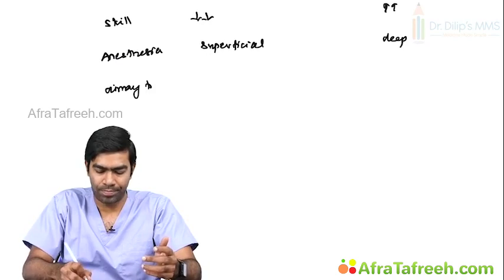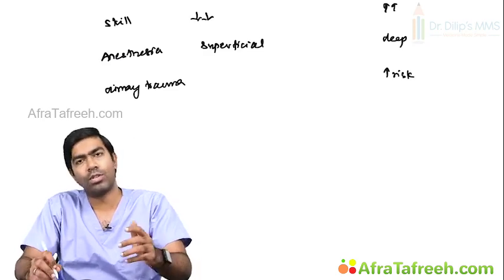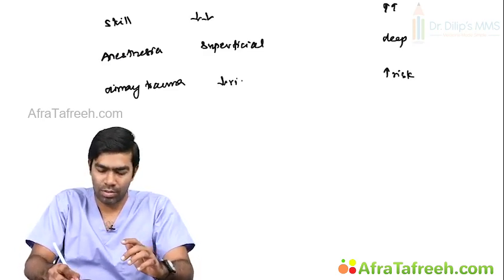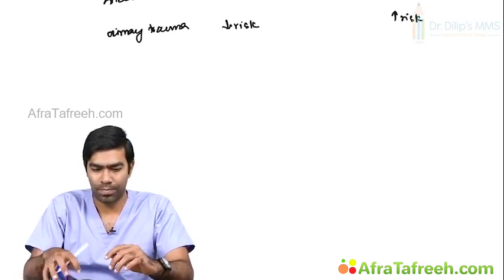And airway trauma. You all know that endotracheal intubation has a higher risk of producing an airway trauma, whereas supraglottic devices have definitely a lower risk of producing an airway trauma.